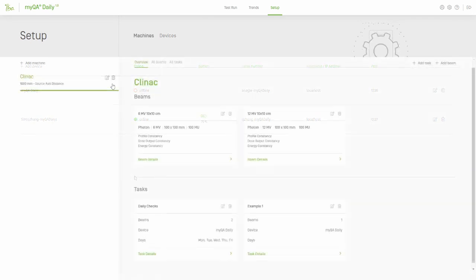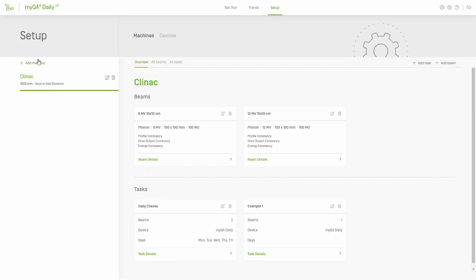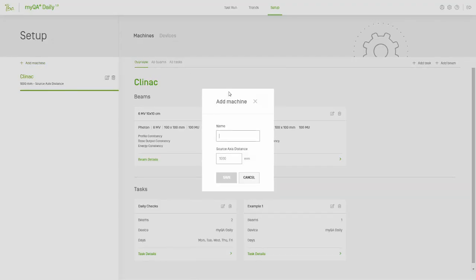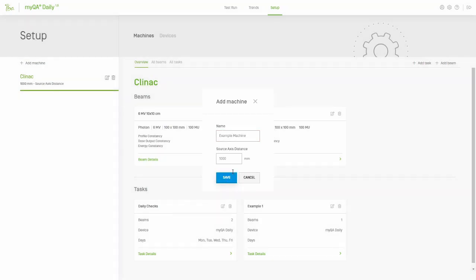The interface for adding a machine is similar to that for a device. Navigate to Setup and select Machines. Then click Add Machines on the upper left of the screen. Many of the details needed to define a machine are actually entered when defining the beams. For now, only the source axis distance is needed.